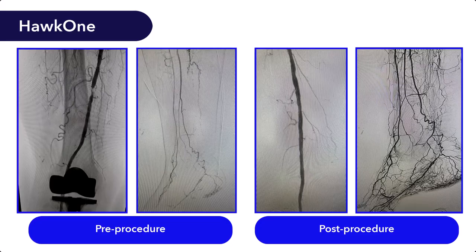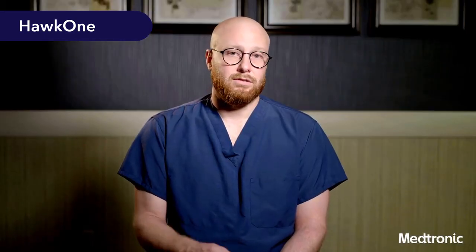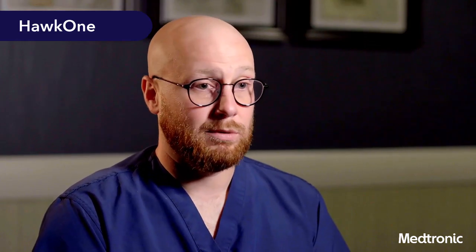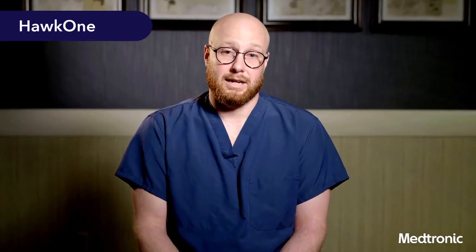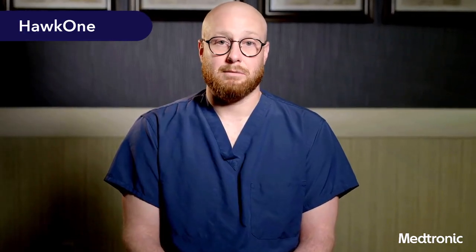And then from there, usually the case doesn't require anything else. We'll shoot the completion angiogram, plus or minus intravascular ultrasound, assessing for any flow-limiting dissections or distal thromboembolic pathology. So this usually is a pretty straightforward case where I only need atherectomy and drug-coated balloon angioplasty to treat this patient, and I don't necessarily need to leave a stent or anything behind.